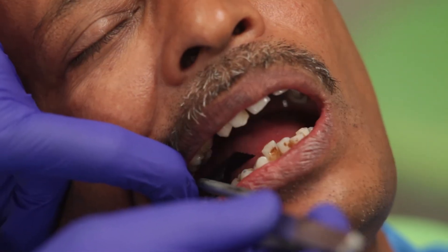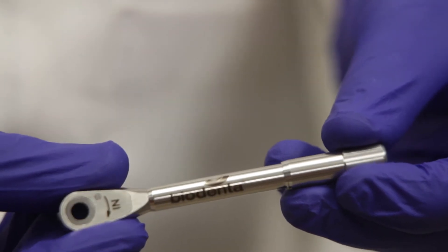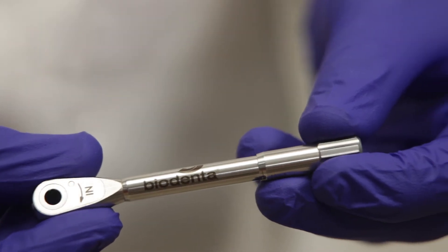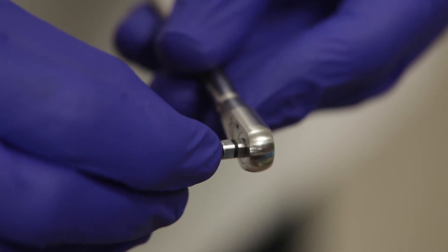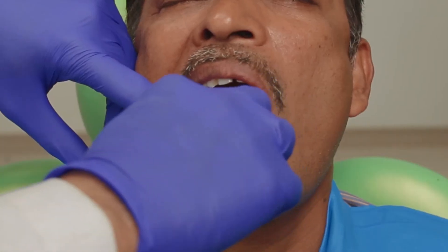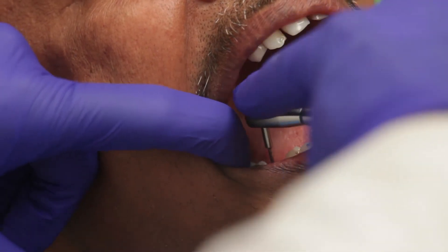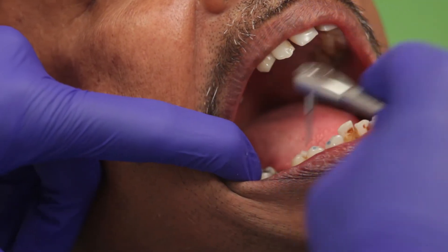After verifying occlusion and contact, the crown is ready to be cemented. Before we go ahead and cement the crown, we need to torque the abutment in place. The torque value for a Biodenta smart abutment is 35 Ncm. So I have set my wrench to 35 and I will start torquing it now. It is very important that the torque values be used depending upon the implant specifications. The abutment is now torqued.